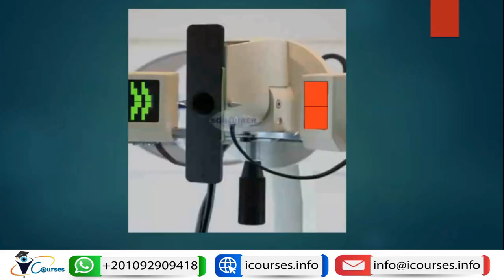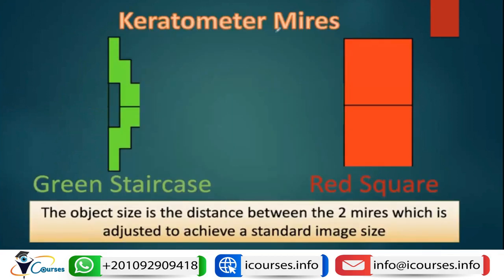If we look at this, this is the objective lens that is projecting toward the patient's eye. So this is the front surface of the device. If you check the front surface of the device, you will find that there are two devices that project illuminated mires. One is a green stepladder, and the other is a red rectangle. These are called the keratometer mires. There will be a green staircase or stepladder, and a red square.